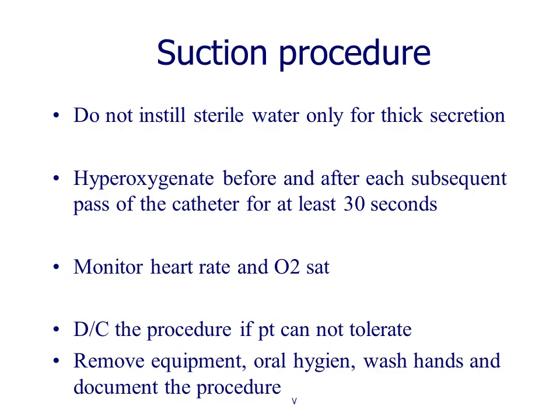The suction procedure is done as needed, when there are crackles or when there is secretion in the airway. Not scheduled, meaning not every two or three hours; no, as needed.